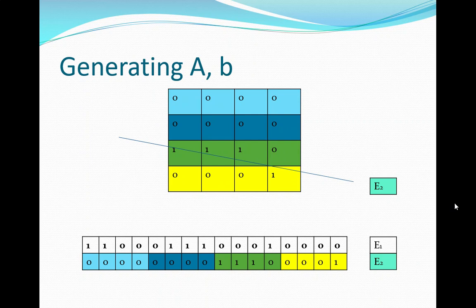We convert that into a water equivalent path length, but I'm just putting energy here because I think it connects better in your mind. It's a straightforward transformation. So what we're saying is I followed this path, I lost this much energy. I followed this path, I lost this much energy.